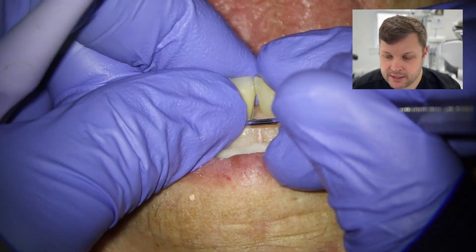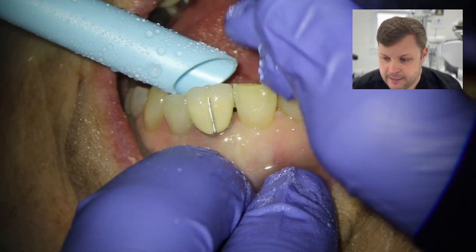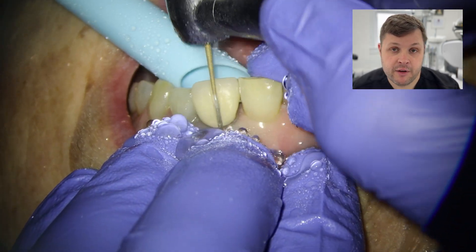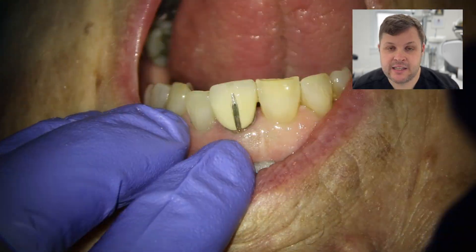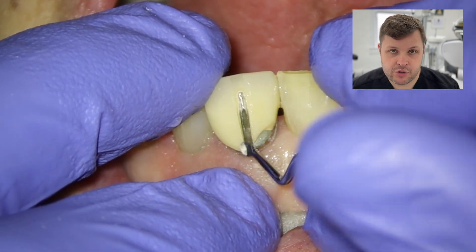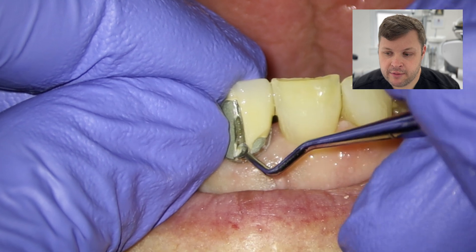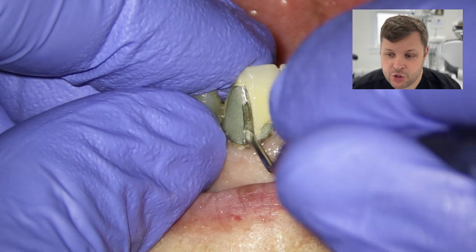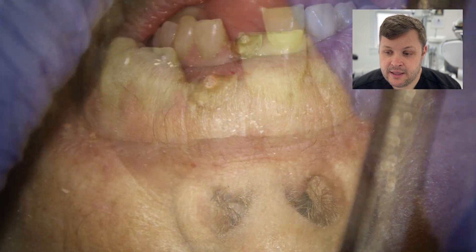The crown was properly solid, so I had to physically drill it off. I drill a channel down the center of the crown, then undermine it with an ultrasonic tip, then use an excavator to peel back the margins of the crown — some of the ceramic comes off — and as you peel back the coronal margins, that dislodges the crown. You'll notice that the core of the tooth was fractured inside the crown.